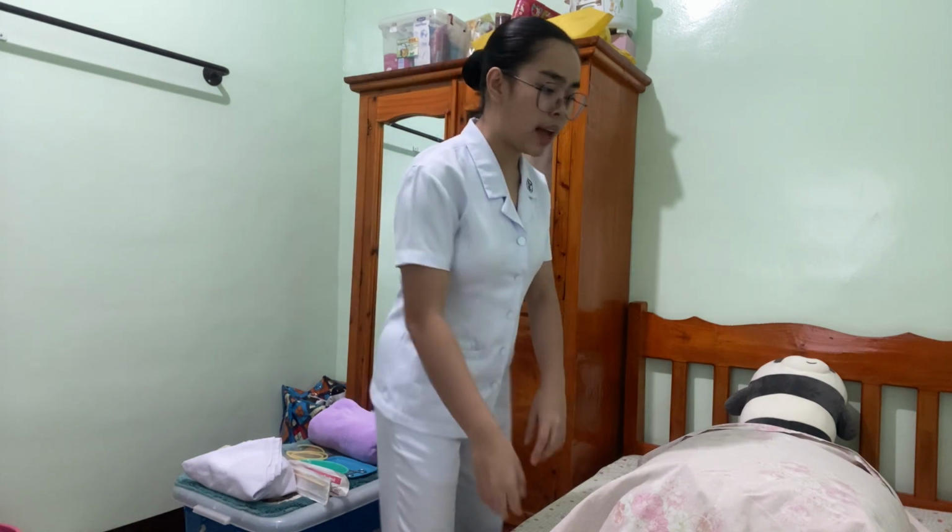Okay, so now we have to position the patient in a dorsal recumbent with the knees flexed. So this is done to provide good visualization of the meatus where we will be introducing the catheter. Also, the gravity will aid the flow of the urine when the bladder is higher than the end of the catheter. So ma'am, can you slightly flex your knees?